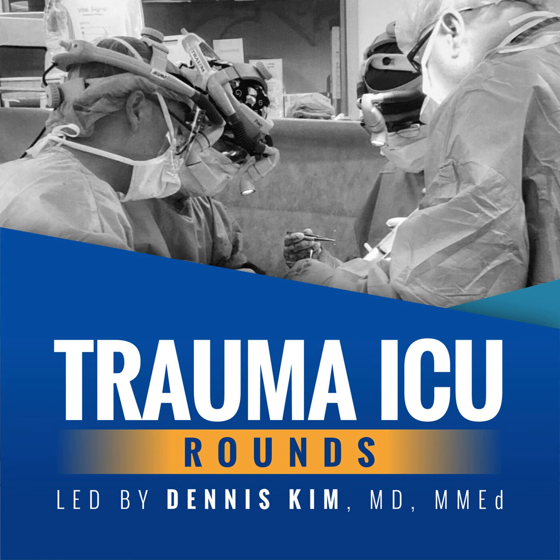When it comes to the type of breath delivery, there's really 3 types of breaths. They're either mandatory, and these are breaths for which the ventilator controls the timing or tidal volume or both. We have spontaneous breaths in which the patient controls the timing and tidal volume, or assisted breaths. And these have the characteristics of both mandatory and spontaneous breaths. In an assisted breath, all or part of the breath is generated by the ventilator.